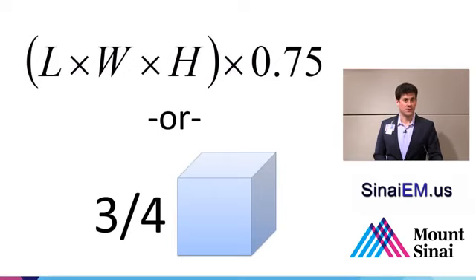And again, you can assess basic, binary stuff, like is it greater or less than 150 cc's, or you can get reasonably accurate. So if you need it down to the cc measurement, you'll probably need to put a catheter in them. But if you just want to get a sense if they're fully emptying their bladder or not within reason, you can use these non-invasive assessments, again, which are simple, use less resources, and certainly the patients typically thank you for that.